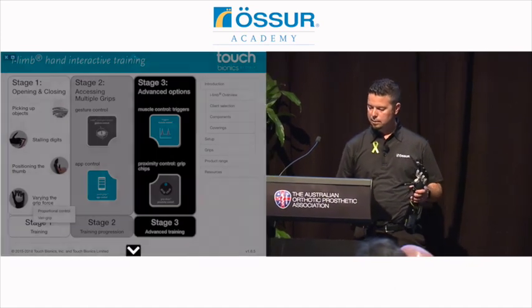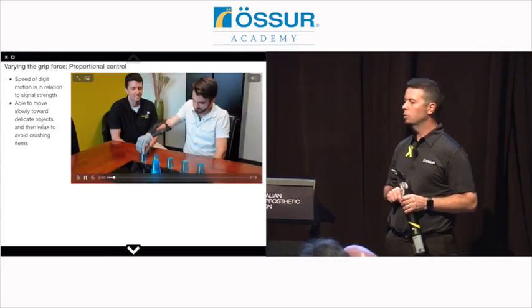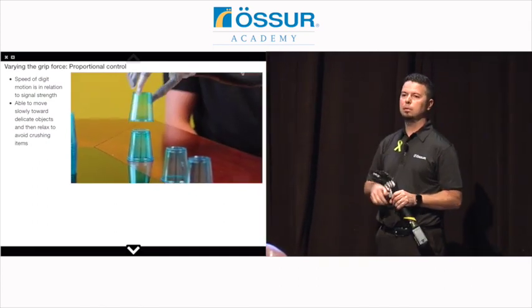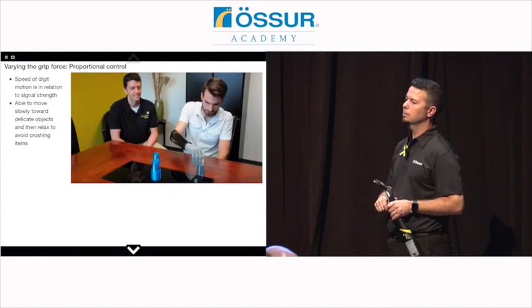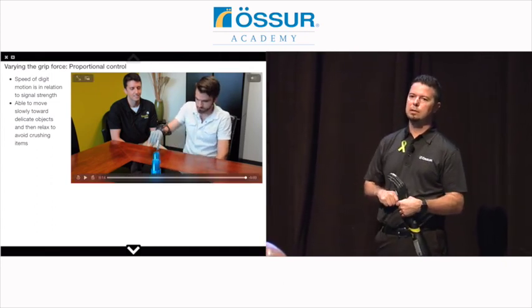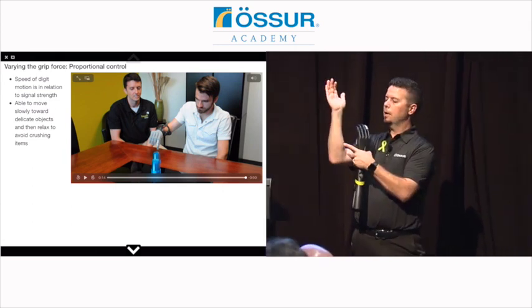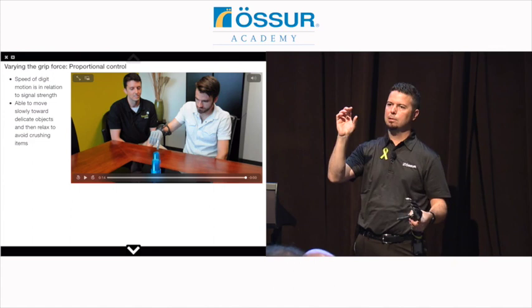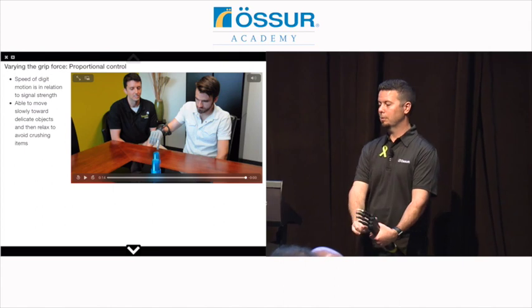And then the last thing in stage 1 that you're teaching a user is varying the grip force. The first thing is proportional control. A good way to practice that is with something delicate like a little shot solo cup. Soft and flexible, something that if they crush it, it's not the end of the world, but they can really work on controlling the speed at which they close the device. It's just like the gas pedal in your car. Proportional control is the same thing. When you fire the muscle hard and strong, the hand moves fast. If you just lightly contract the muscle, you get that slow motion. So when you're pulling out of a parking space, you want to just lightly tap on the gas pedal, right?